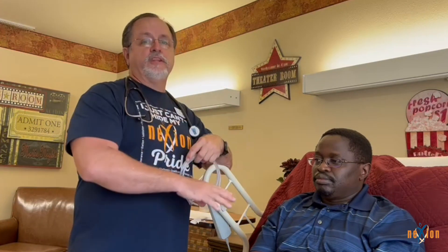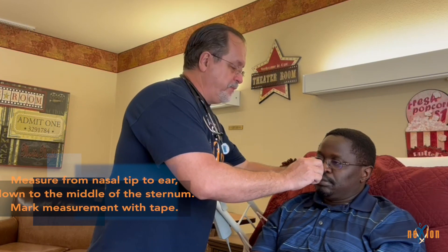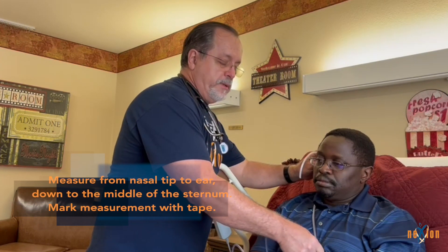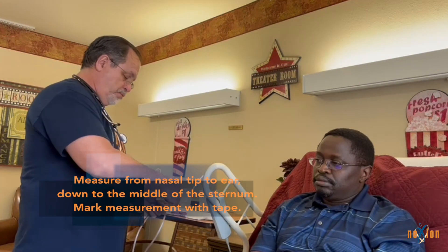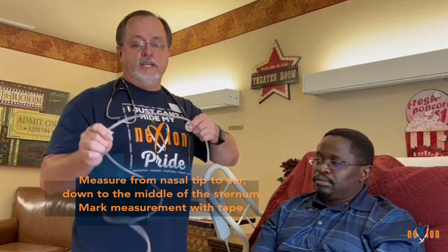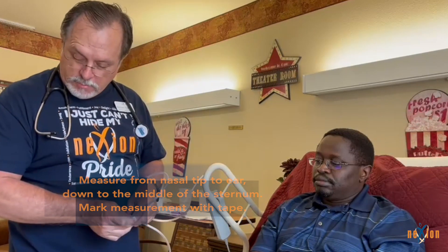Once you've gathered all your equipment and have the resident ready, explain to them what's going to happen. First, make sure the resident is in the high Fowler's position, sitting straight up. Then take the NG tube and measure it for the appropriate length — from the tip of the nose, to the ear, then from the ear to the middle sternum. Once you have that measurement, put a piece of tape on the tube to mark the length.